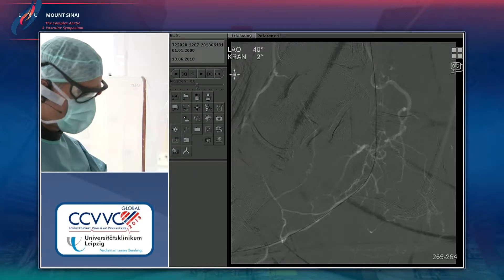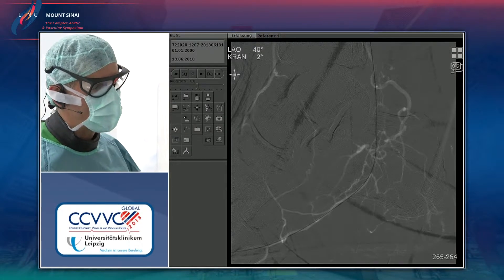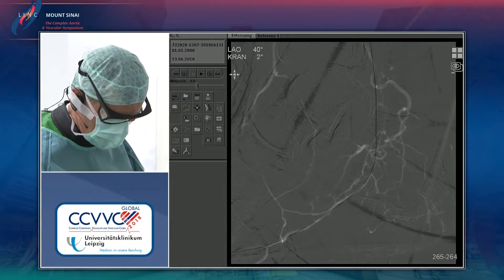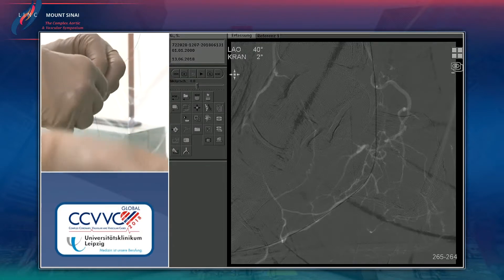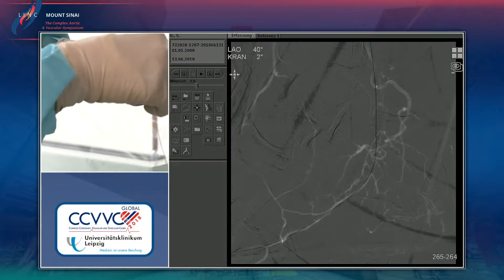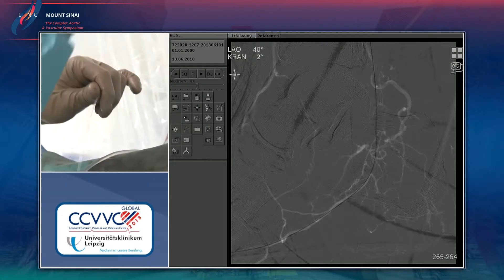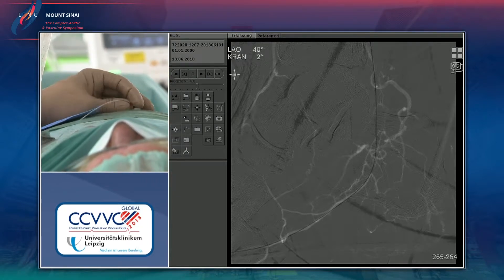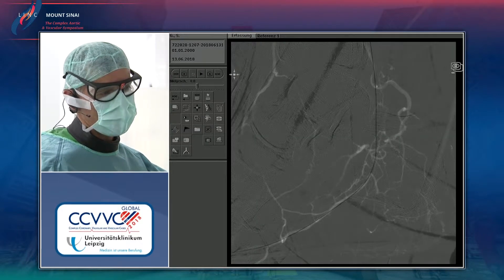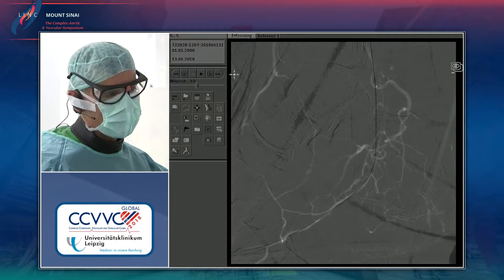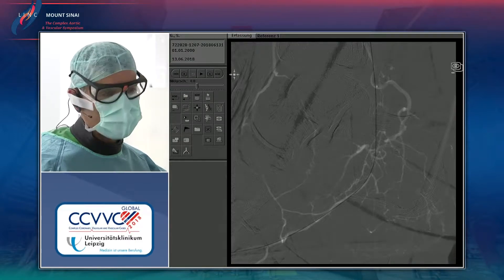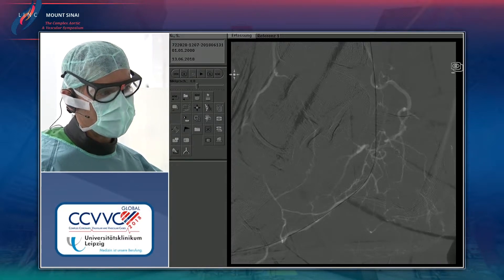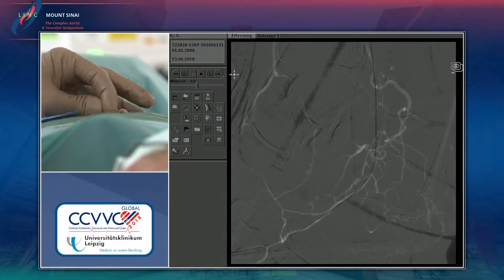A two-millimeter diameter balloon was used, which should be sufficient. There are reports of using 2.5 or even 3 mm balloons in forefoot arteries and foot loops, but in a relatively healthy distal segment, oversizing risks creating dissections at the distal balloon shoulder. The plan is a 2 mm distal / 2.5 mm proximal, 210 mm long balloon going in now.